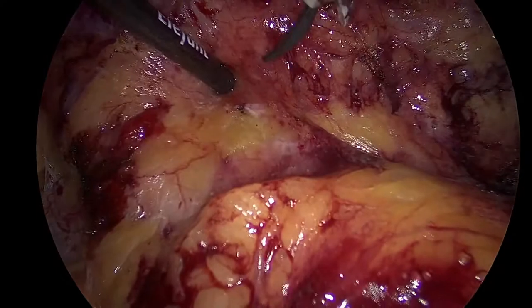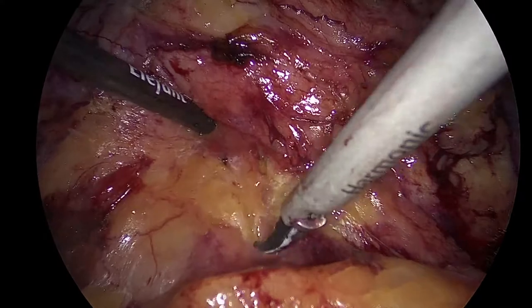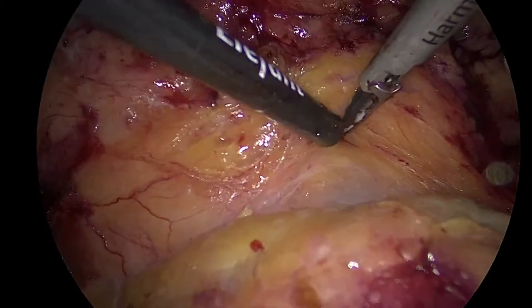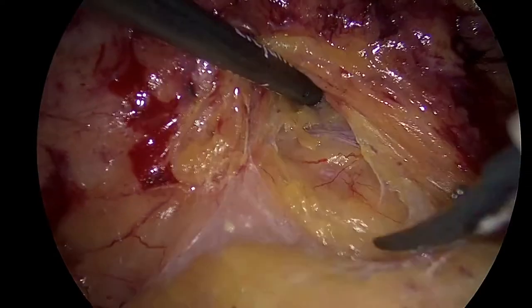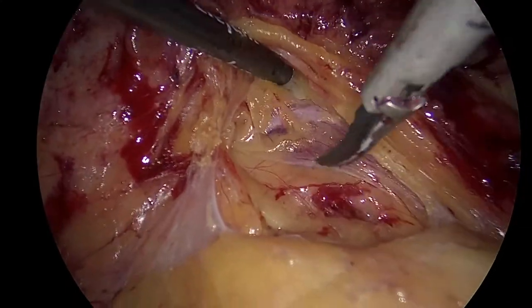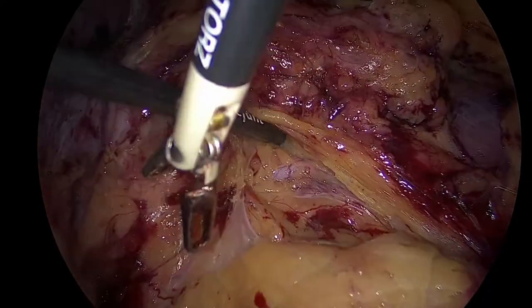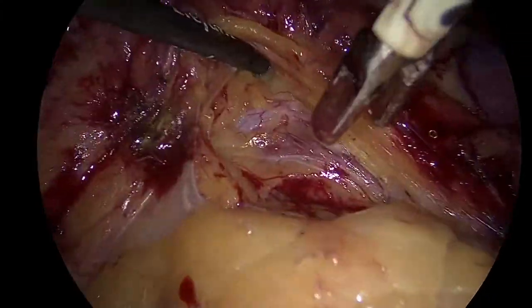Again, I said, I'm cutting up here. Now it's important to find the ureter. So you see how everything peels down nicely. Now the trick to find the ureter is you just lift up with one instrument. Show me further up. Start dissecting with the other. Here's the ureter. You see it? I think ureter is here. Now, give me the bipolar so I can clean my field. Just clean here, because it's nice to have nice clean anatomy here.